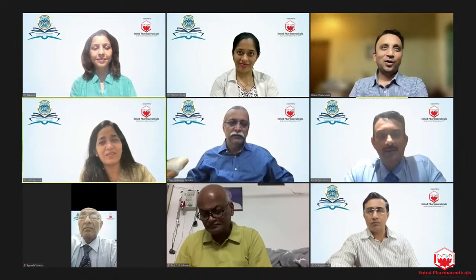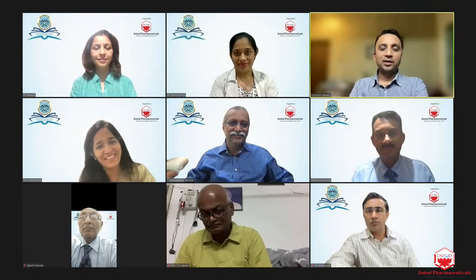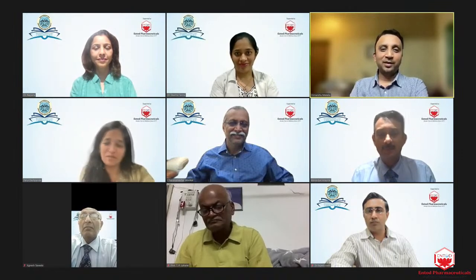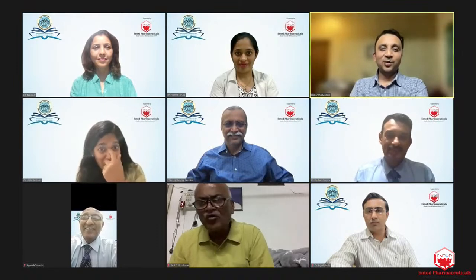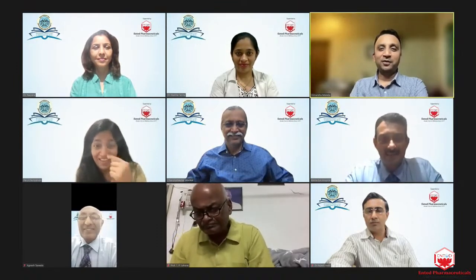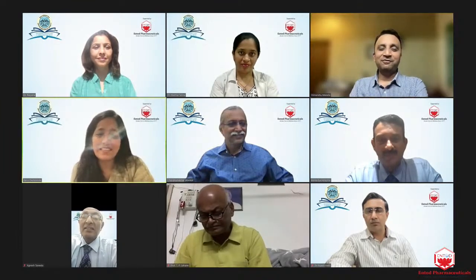Vaishal, do you have any? The answer to that is how sure you are that you're going to hit emmetropia. Beating your chest there and promising the patient, I'm offering you a toric multifocal, you're spending a huge amount of money, but I'm not sure about the outcome. You're not sure.